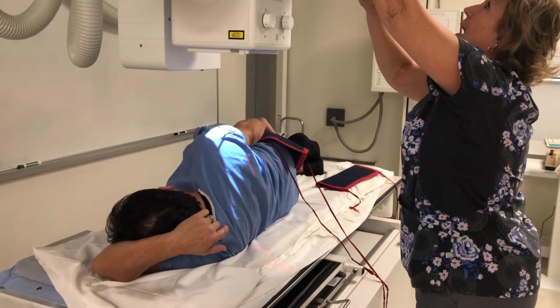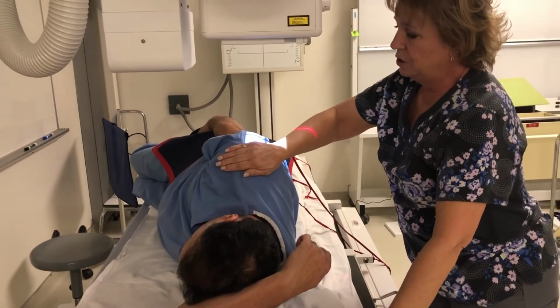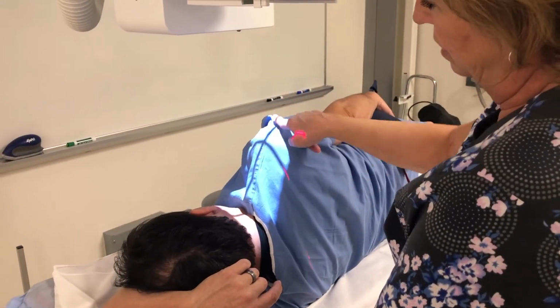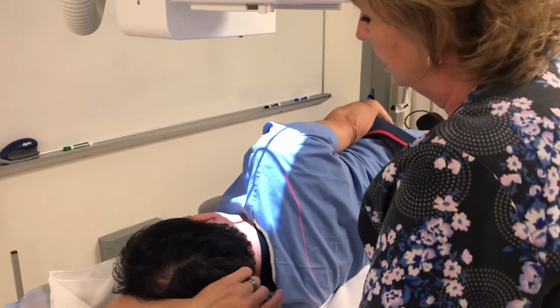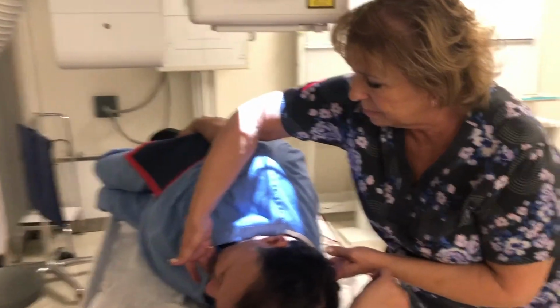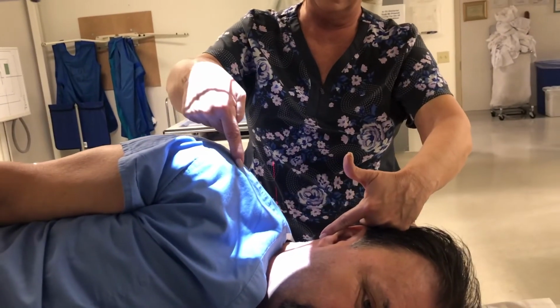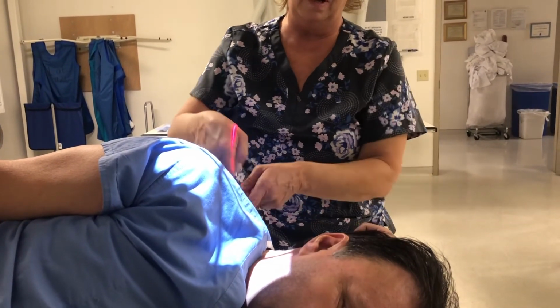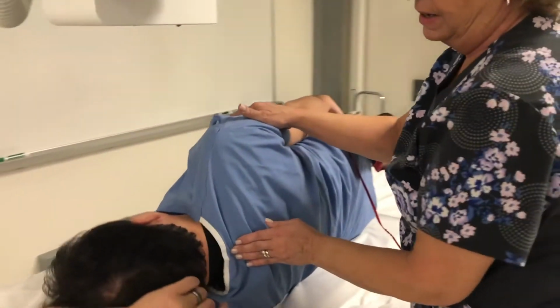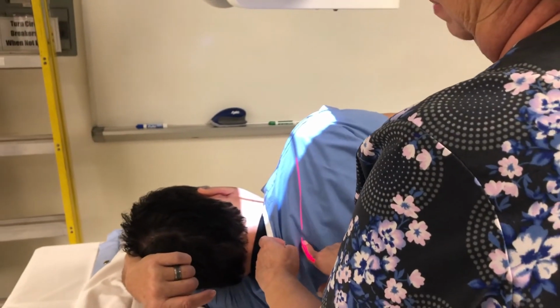And I'm going to be centering at the junction of C7T1. So again, with this shoulder depressed, I'm pretty much going to just be skimming the top of his shoulder. That's where my central ray is going to enter. Raise your chin just a little bit. I'm on the mid-coronal plane, which is where his spine is, and I'm centered. It's passing through at the level of C7T1. You can feel back here the vertebral prominence, so I know I'm just below C7 and I'm entering right between C7T1.